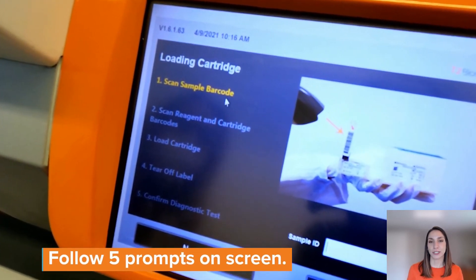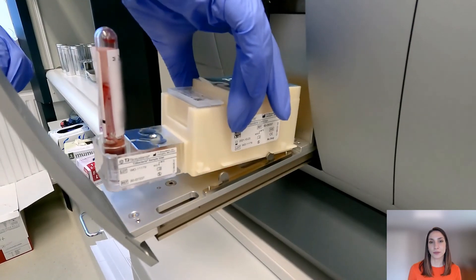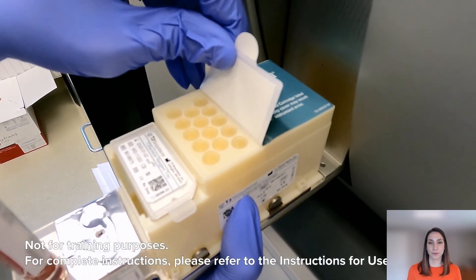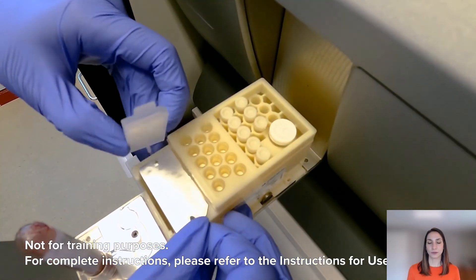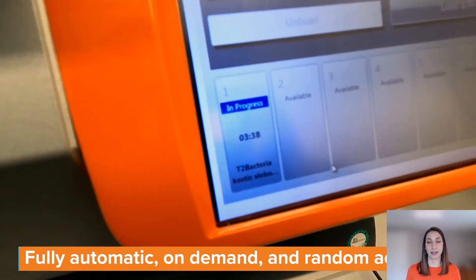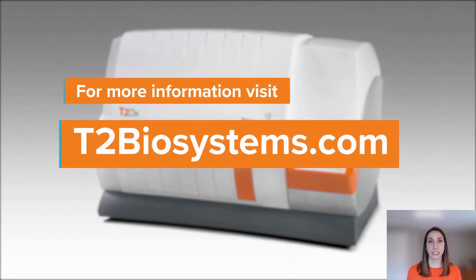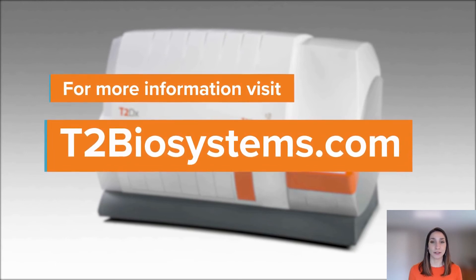Using our touchscreen, there will be five easy prompts that you will follow. You'll scan the sample, the reagent, and the cartridge kit barcodes. Then you'll remove the label from the top of the T2 Bacteria cartridge to reveal the consumables, and remove the reagent lid on top of the reagent tray. Everything will be fully loaded into the instrument and automatically pulled inside. From that point forward, it's just three to five hours until you have a result, depending on the utilization of the instrument at that time.